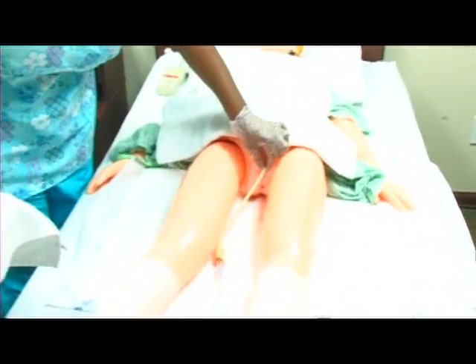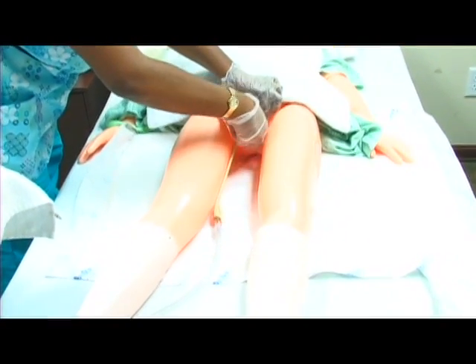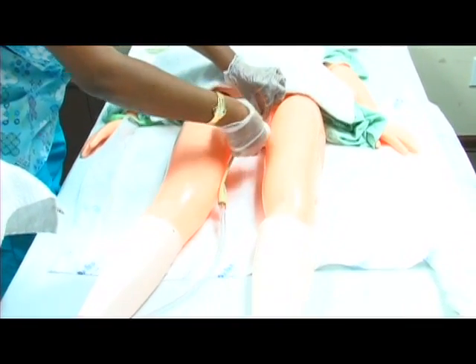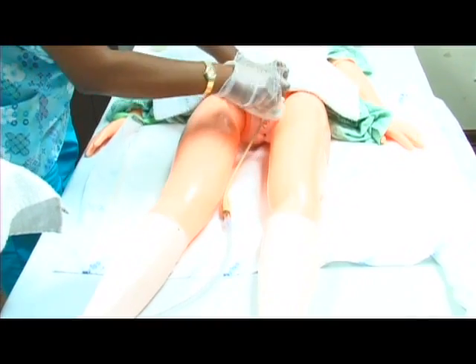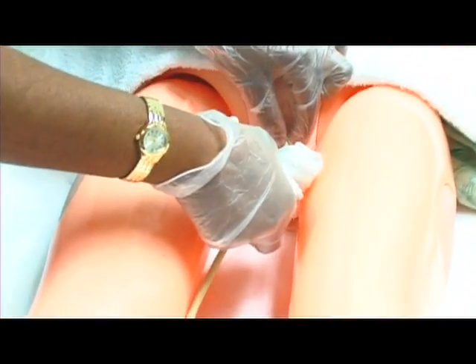We're going to hold the catheter at the insertion point and clean down two to four inches. Change positions, hold, change positions, hold.